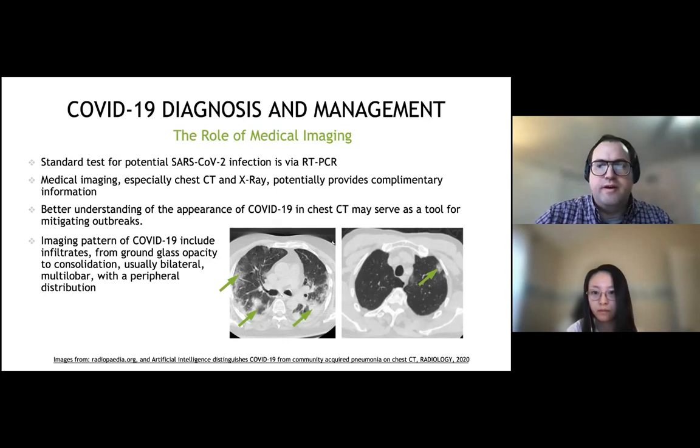So especially chest CT is very rich in information. From chest CT, we can get very rich information about the infiltration of the lung disease or COVID-based pneumonia by looking at these opacity regions in the lung scan. So you can see different severity of the disease for different patients.